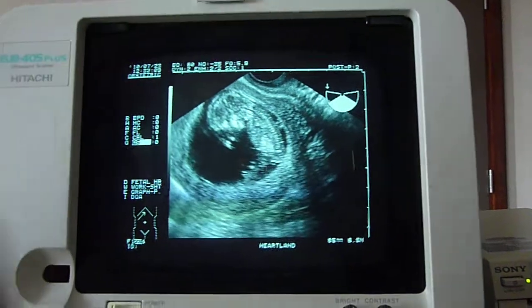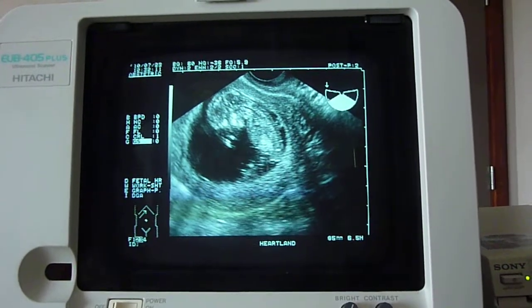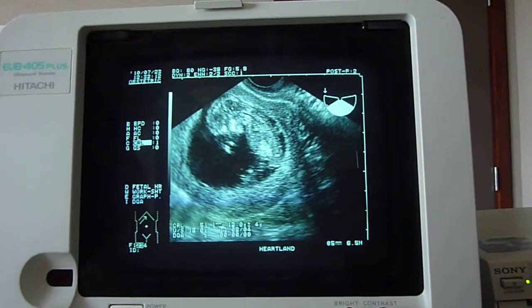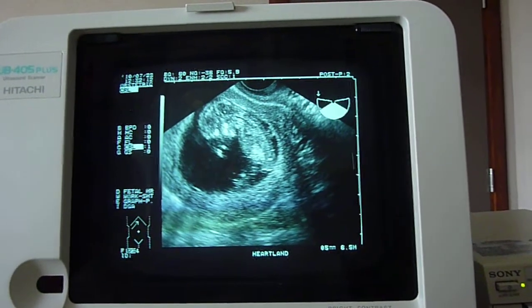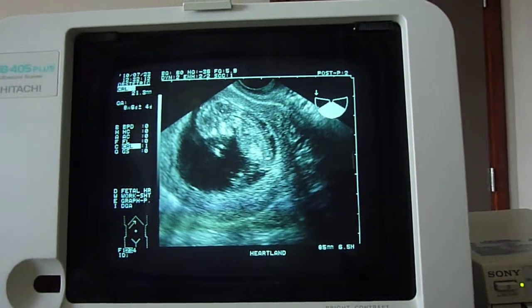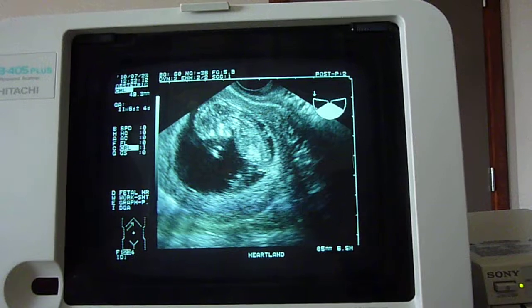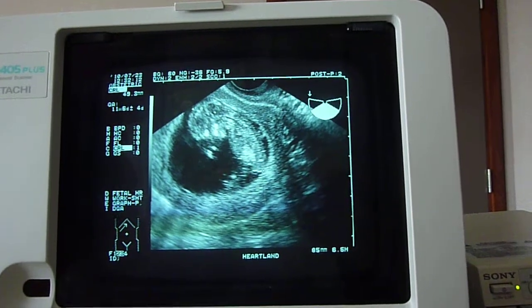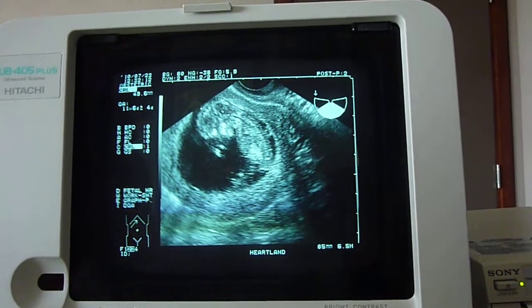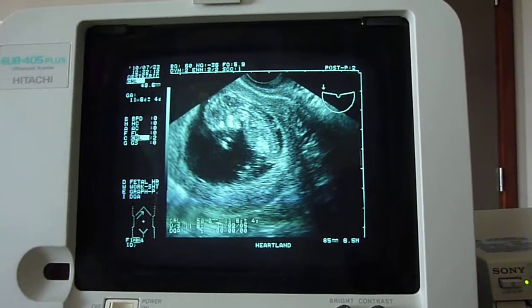So you actually have a really nice view — baby's been very cooperative, sitting comfortably for us to see. We're just going to do a measurement of the baby, and it's a nice crown-rump length. Now this gestation is always a little bit too early to sort of see the risk of any anomalies or things like that, because we're really looking for just viability and number here.